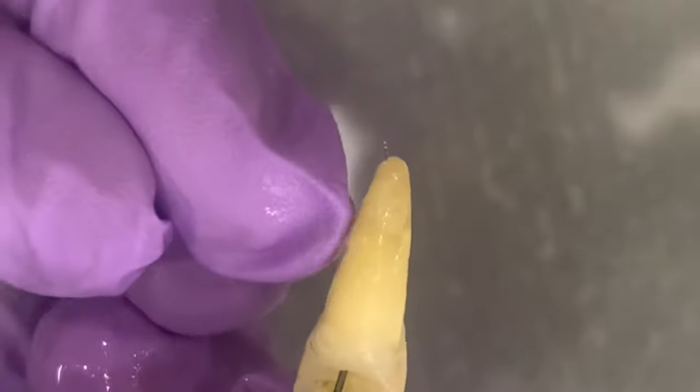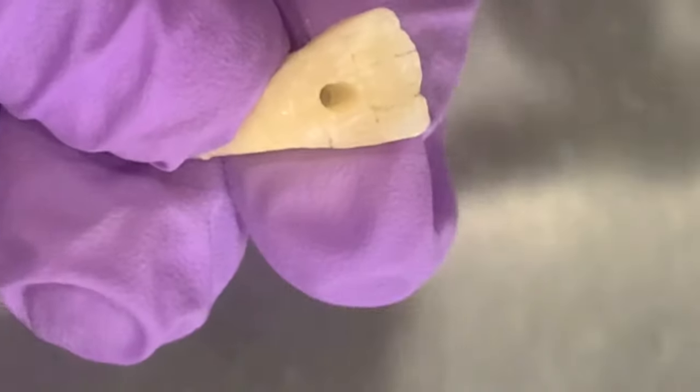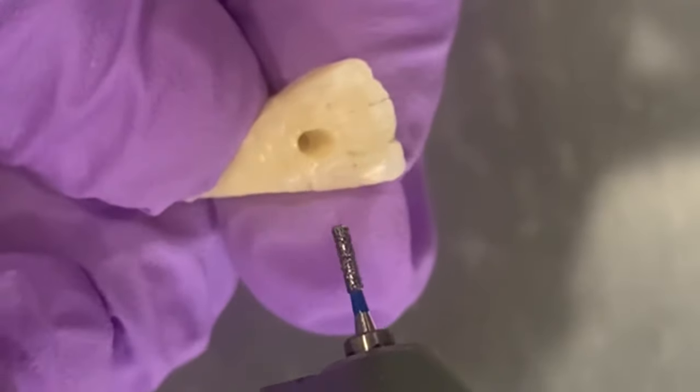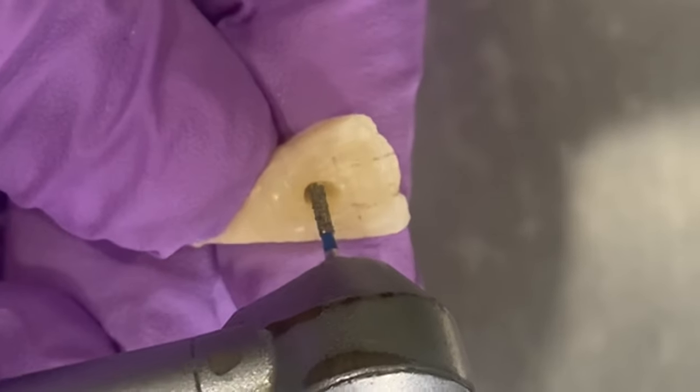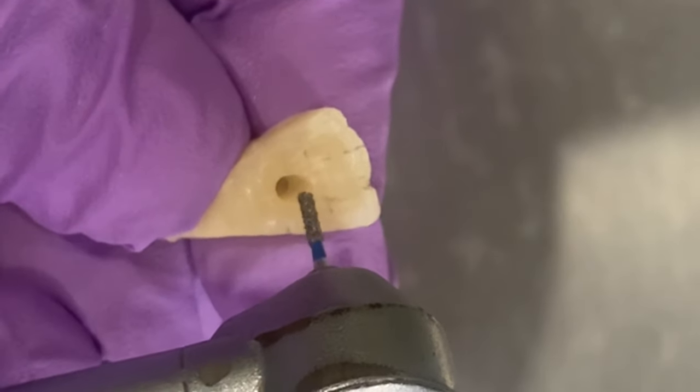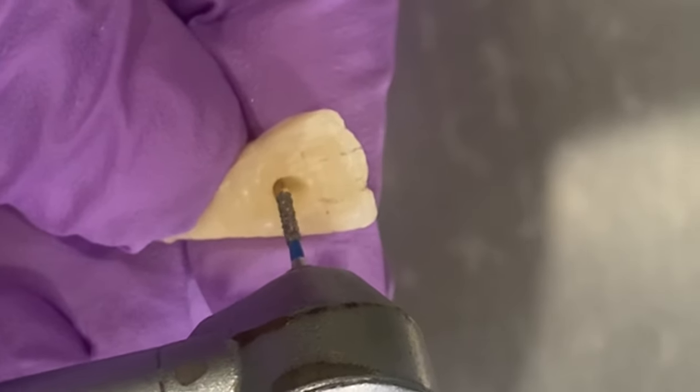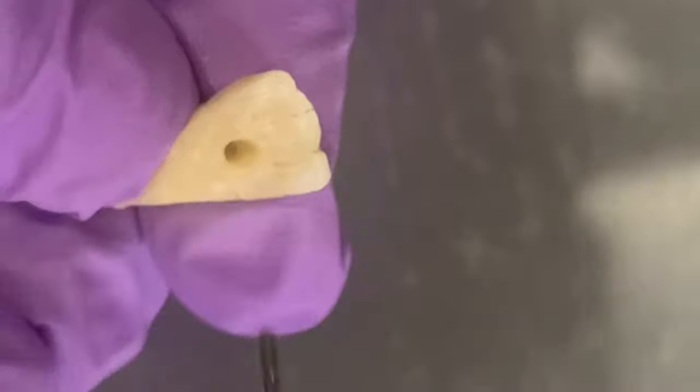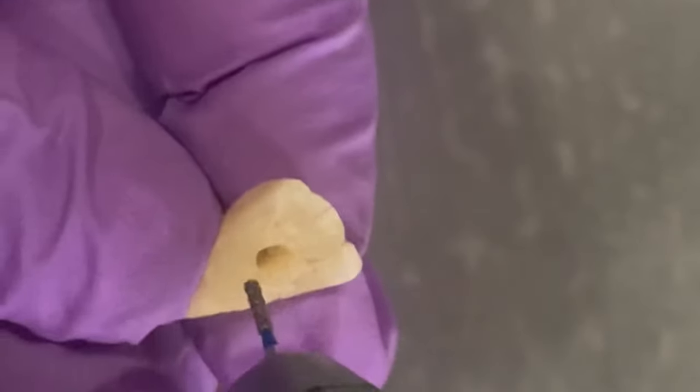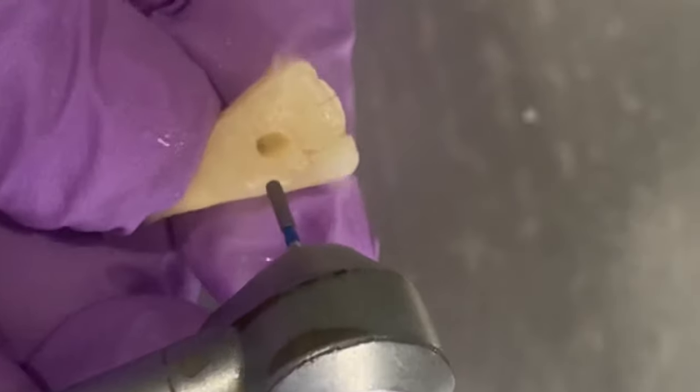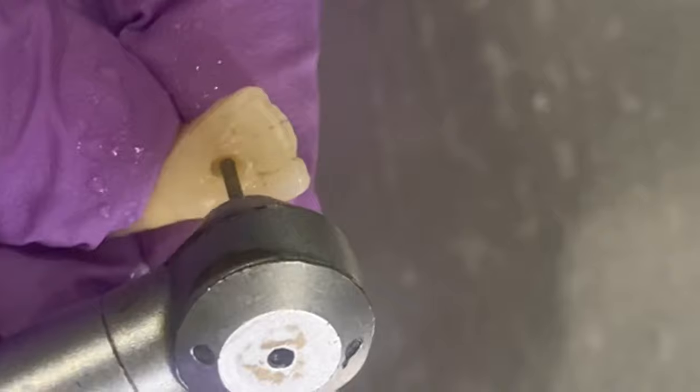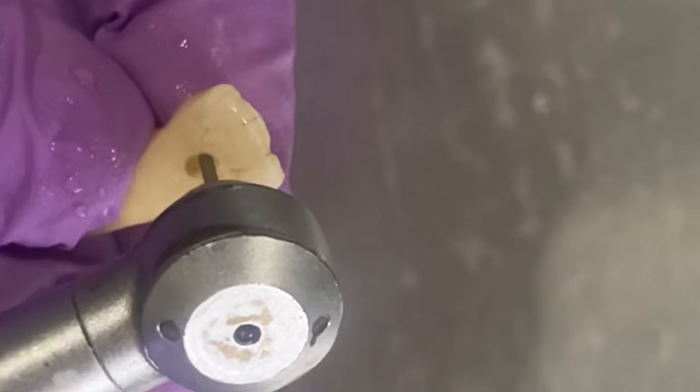I will use a straight bur to give proper shape to the access cavity. You see, the purpose here is to completely de-roof the pulp chamber so that we are able to remove all the pulp remnants from the crown portion of the tooth.